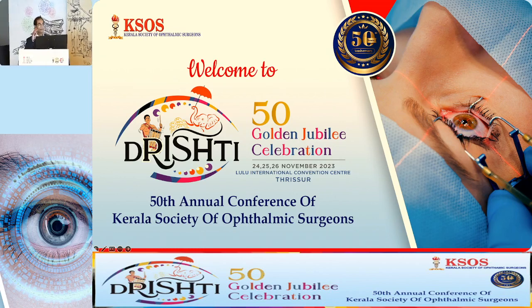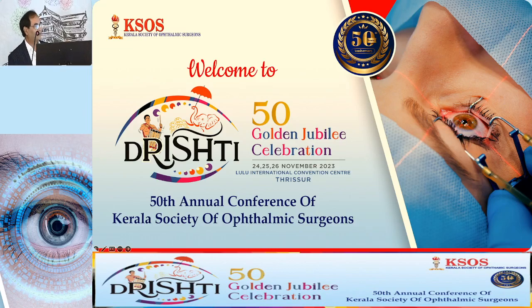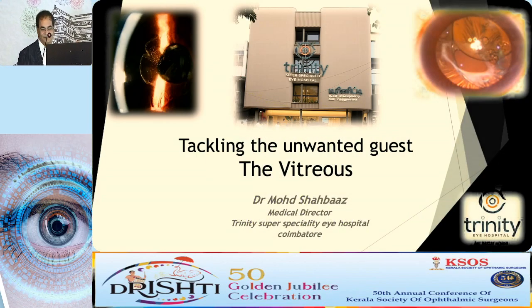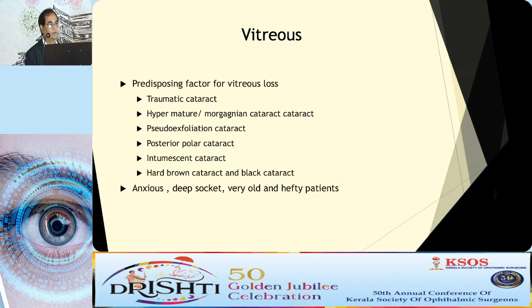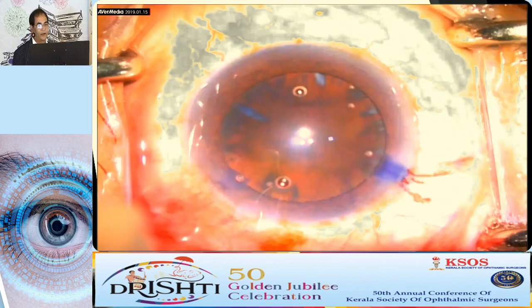Good afternoon all. I'd like to thank Dr. Sandhya for giving this talk to me. And I think most of the part is covered by Dr. Soni itself. So I'll just show you the videos. I'll skip the first 2-3 slides. These are just the indications and precautions you have to take. So we'll directly go to the videos.